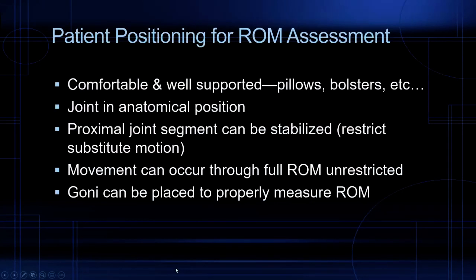So here's some basics. You always want to make sure the patient is well supported and comfortable. Use whatever pillows you need to. I will actually take points off if the patient is not in a good, supportive, comfortable position for you on your skills checks, okay? Also because it's important to use pillows and bolsters, and you'll see in Clarkson how to exactly position and whatnot, because that actually puts your joint in the best position to be measured too.